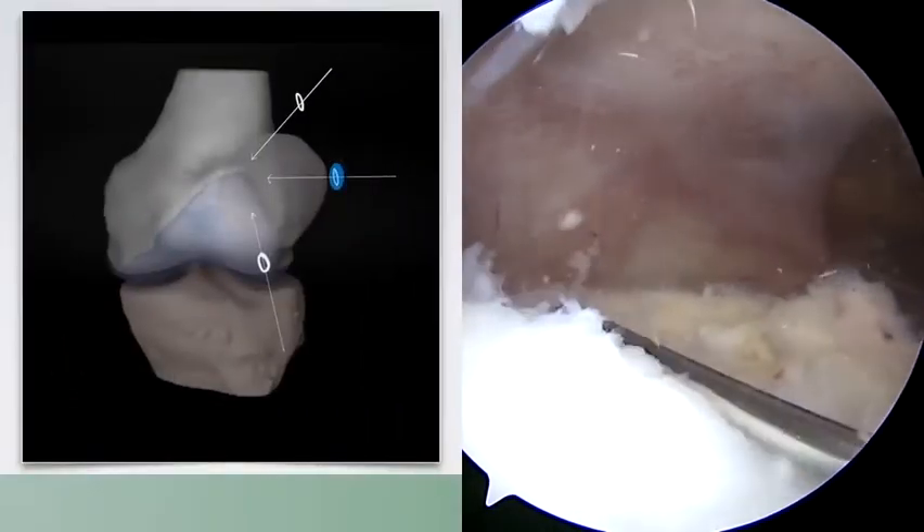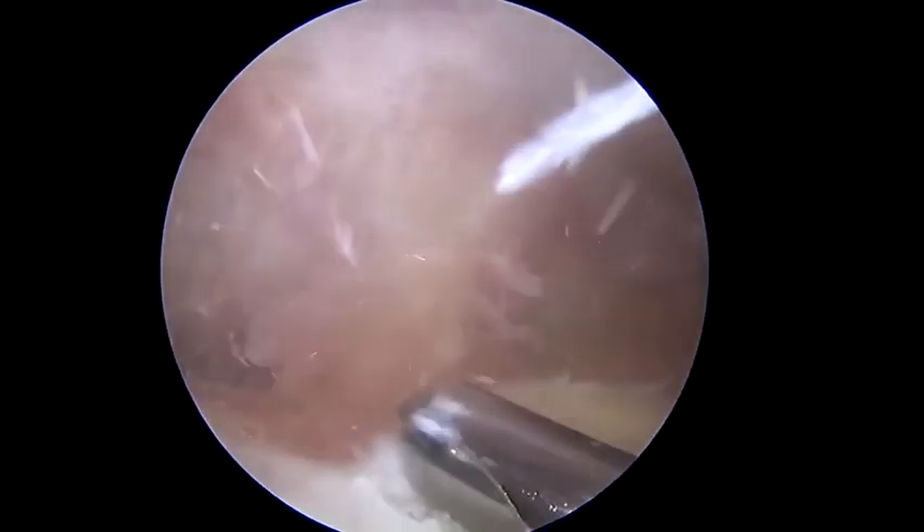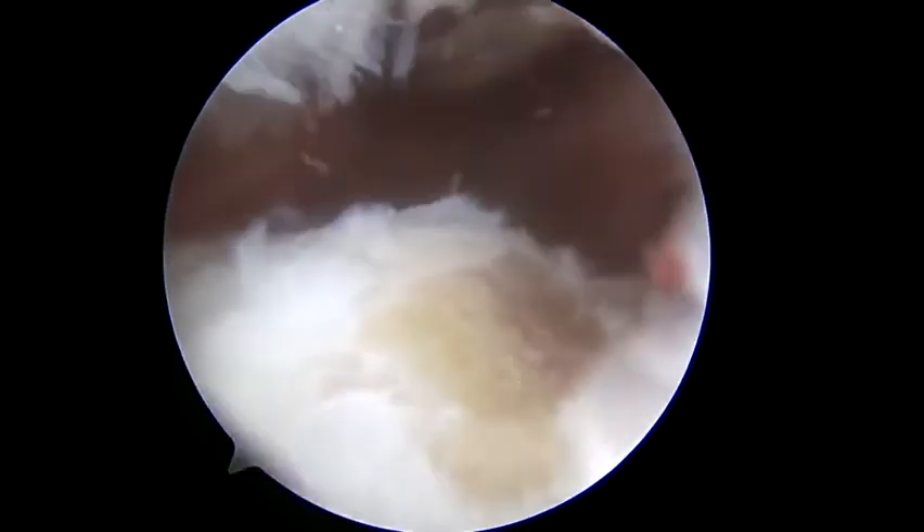Here we see spinal needle localization of the direct lateral portal. We can use this for easier access to resect the remaining component of the spur perpendicular to where the spur is located. It is important to carry this resection from all the way lateral to medial. We can then move our camera to the superior lateral portal and have our shaver through the direct lateral portal to visualize the resection from another viewpoint to make sure it is adequate.